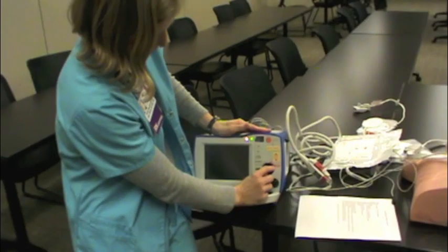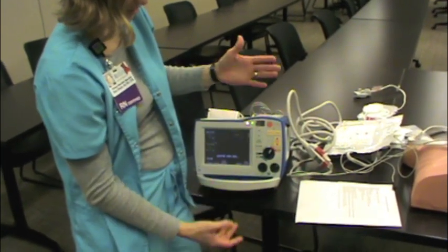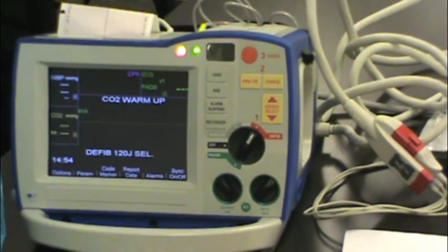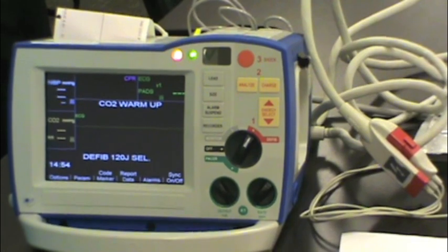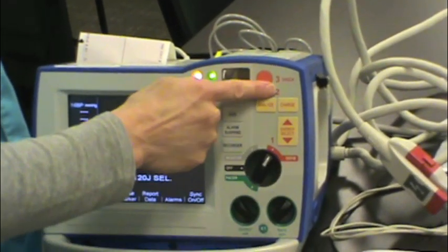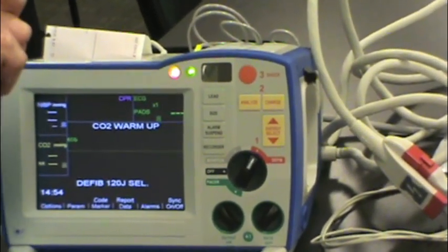The other mode is defib mode. To use it as an AED, you would just turn that to defib, hit analyze, and listen to the prompt. Step one is defib, step two is analyze, and step three is shock if a shock is advised.